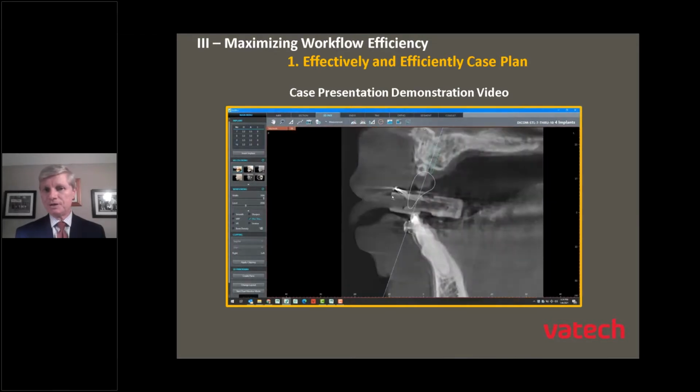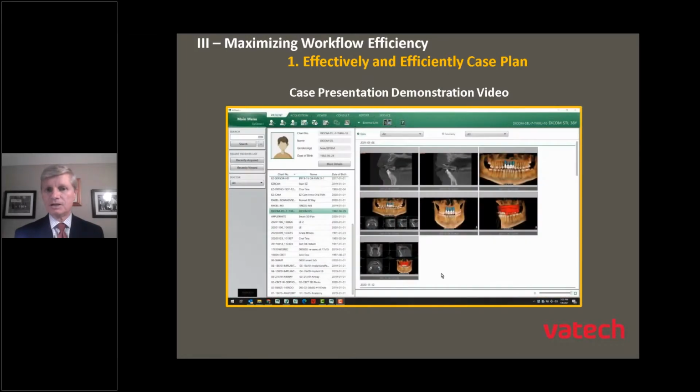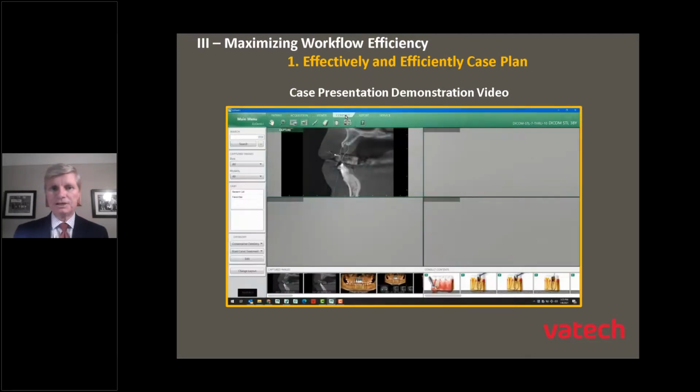I'll double left click, and now I'm looking at the implant at just that site. I'll click on my camera now for probably the 5th or 6th time now in that region. And now I'm simply using the center wheel of my mouse, and I'm rotating through this. And now I'm doing a screenshot of the virtual implant for tooth number 7. So now that I've done that, now I've got 7 images that I've captured from the 3D software.